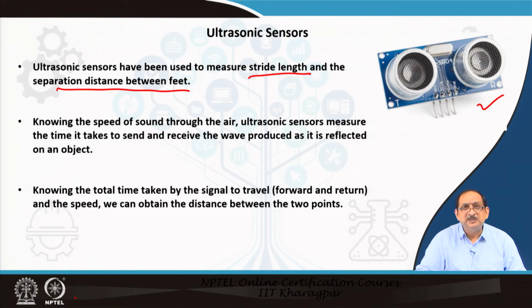Knowing the total time taken by the signal to travel forward and return and the speed, we can obtain the distance between the 2 points.